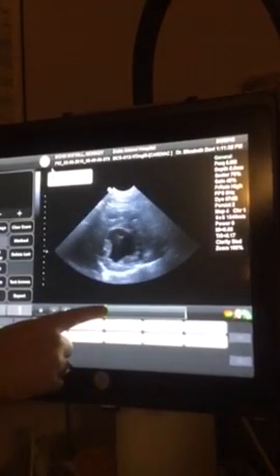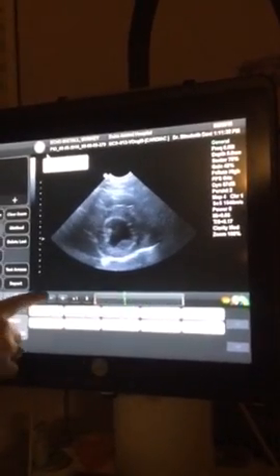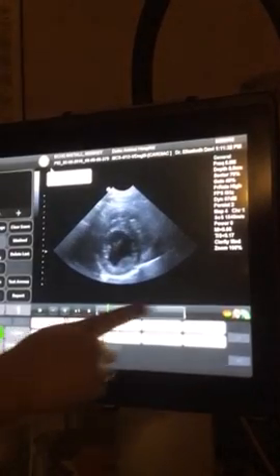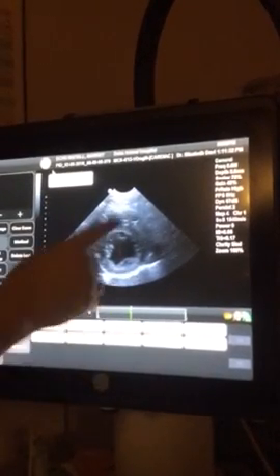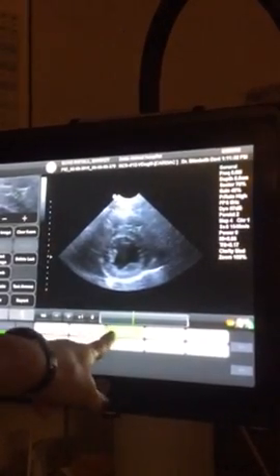See, that was another time where I had to give up. I didn't know how to get rid of the numbers. You just hit the green scroll bar or the plus or minus sign. You're just moving the heart into another phase, and that will get rid of it, and that will let you just find your next diastole, and you will start right back over. So the only time you have to press the button is to start.